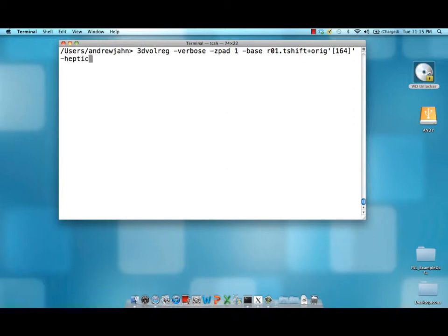We can give it an interpolation method. Heptic is a 7th order interpolation and generally a higher order interpolation will give you better results.